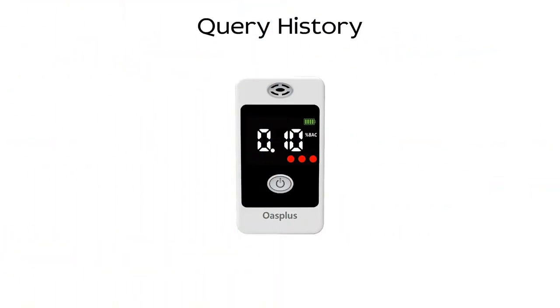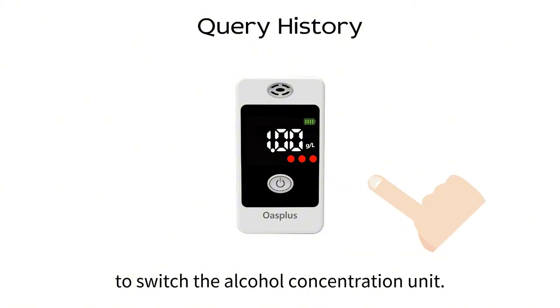Switching units. At the test result screen, press the power button once to switch the alcohol concentration unit.